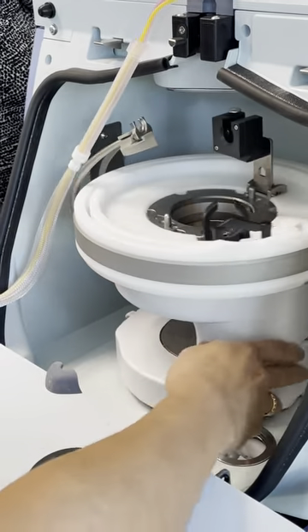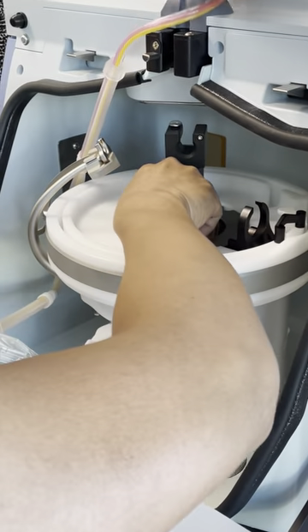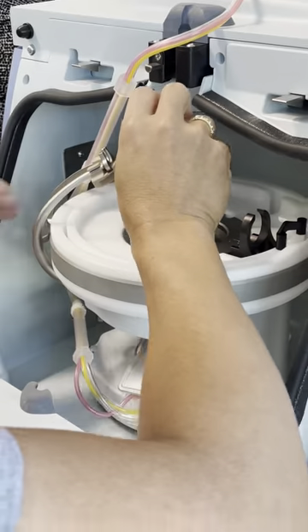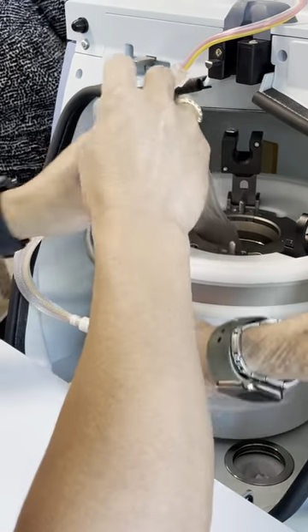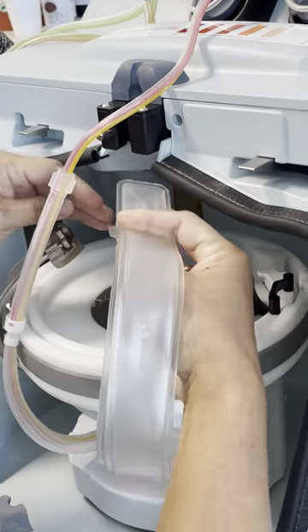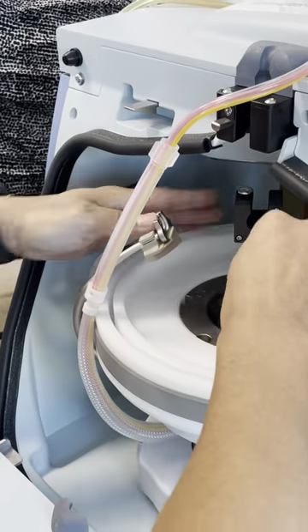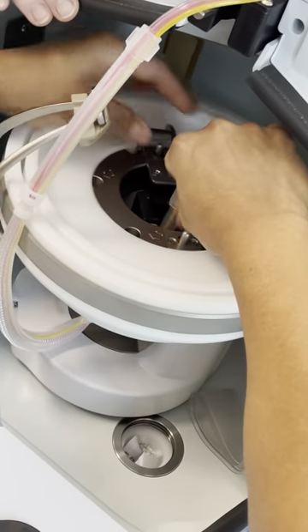There's only one hole here. There's only one hole in the centrifuge, so if it's too difficult you need to reassess. Put down the latch, all the way down.